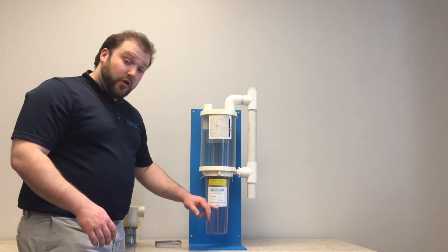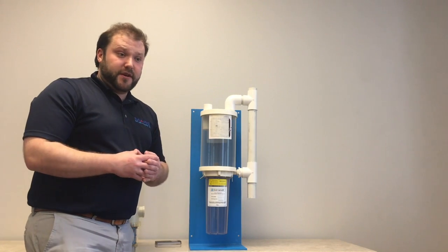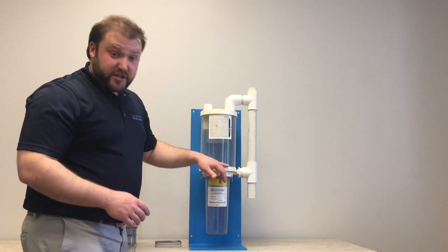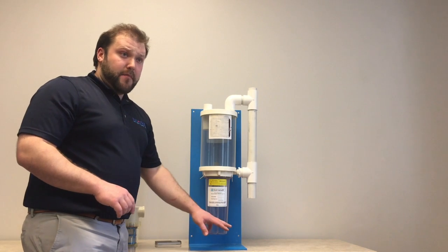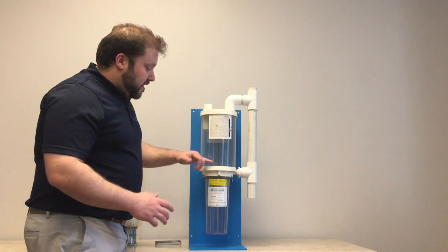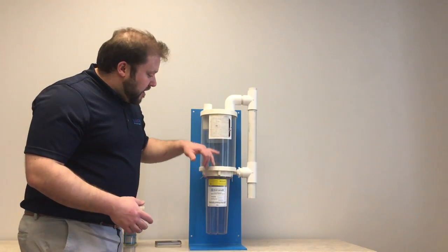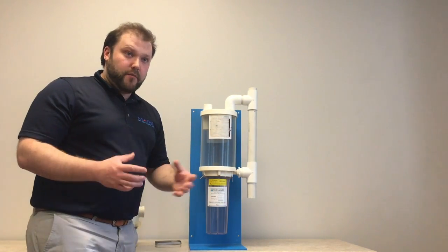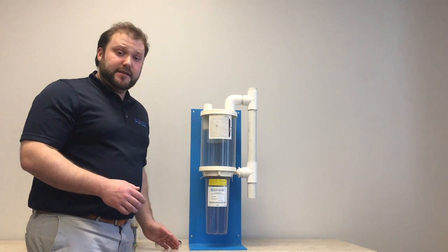If your filter is full and your upper chamber is full, the next procedure is to determine how full. Now, if you have a couple inches in the bottom, when you change out your filter, keep in mind, you'll probably have about 1/3 of your filter full within a short period, let's say a week, because everything up here is going to fall. Now, if your amalgam separator has been neglected for a while and you have significant buildup in the upper chamber, it is recommended the more economical route is to replace the entire system, even if you're replacing it with another SolmeteX.